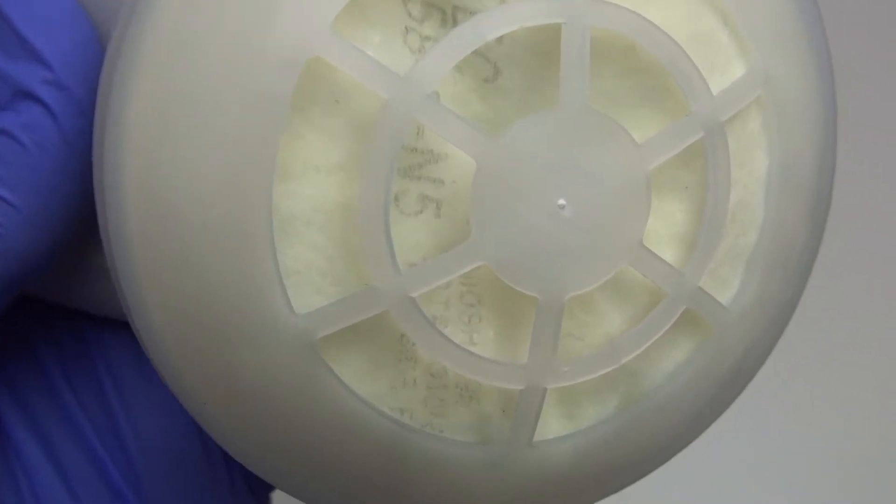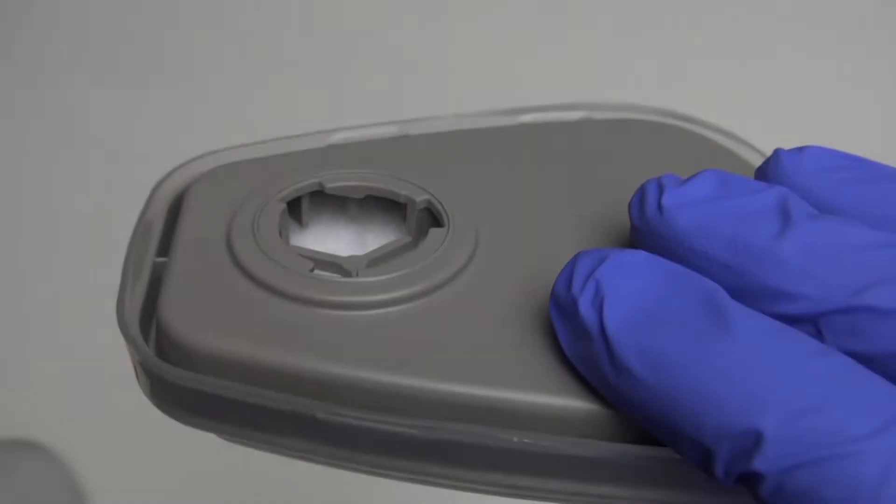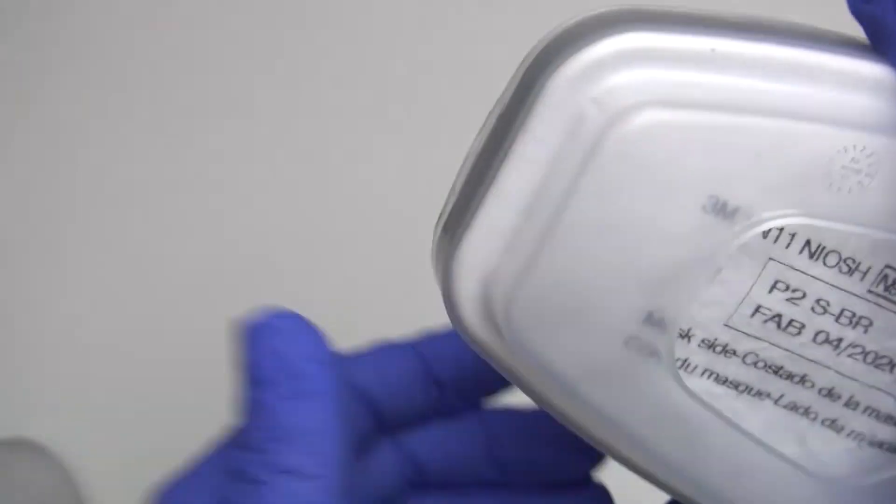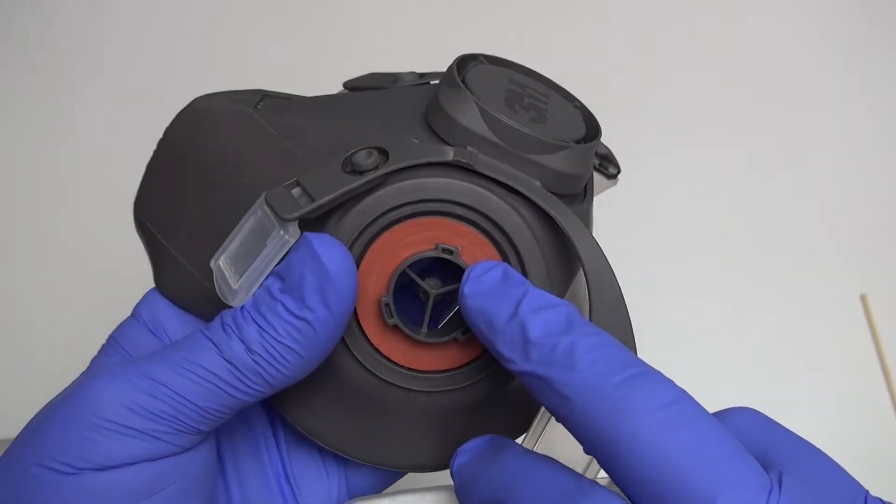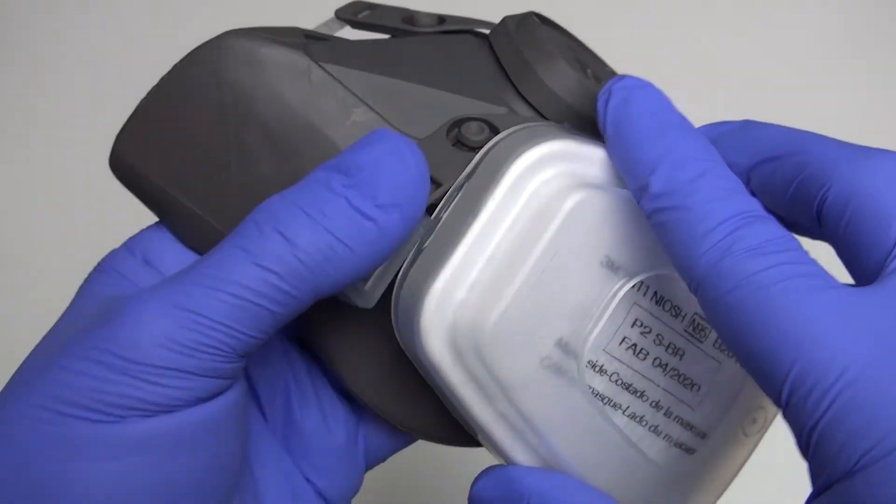Let's compare that to the 3M. I'm going to grab the 3M cartridge here. So this has the detent and you'll see what a difference that makes on the mask. There's the small lug that's the key to make sure it lines up in the correct orientation.